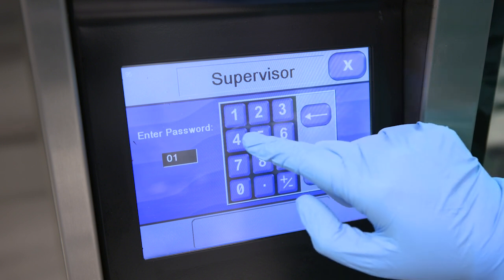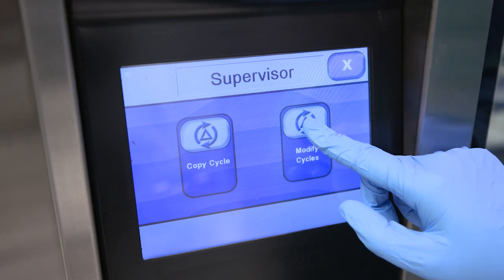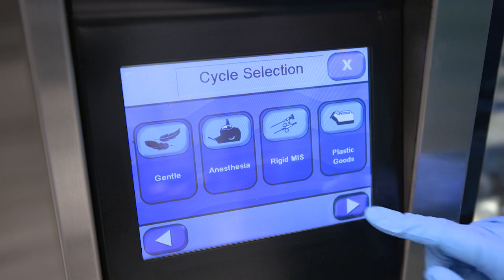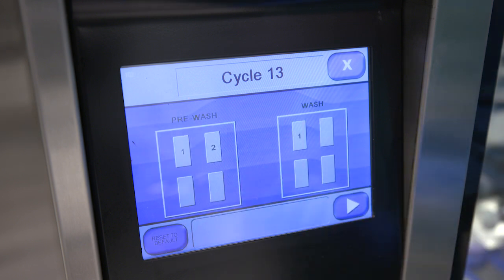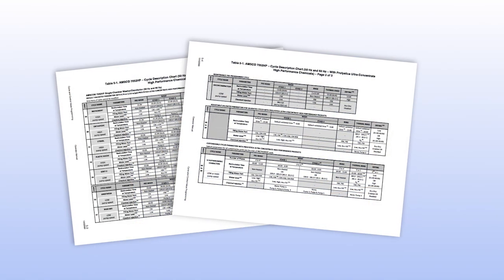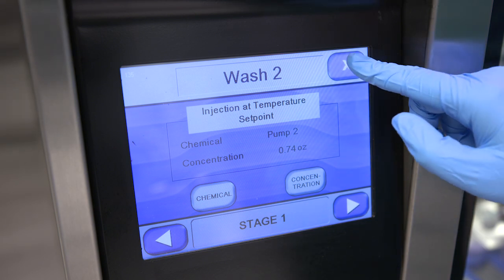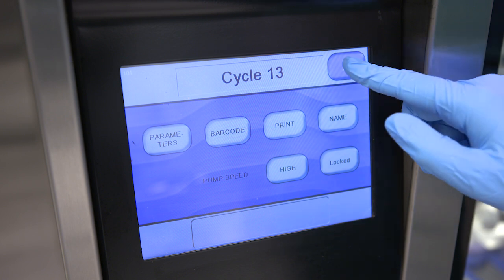You can create a custom cycle by modifying the parameters of a phase, or by adding or removing a phase from the cycle. To create a custom cycle, press cycles, then modify cycles. Scroll until you find the cycle you want to modify, then select that cycle. Next, press parameters, then select which phase you'd like to modify. Follow the instructions to modify the parameters. Not all cycle parameters can be modified — refer to the cycle description charts in Section 5 of the washer operator manual. Once you have made changes, press close. Any changes you've made will automatically be saved.